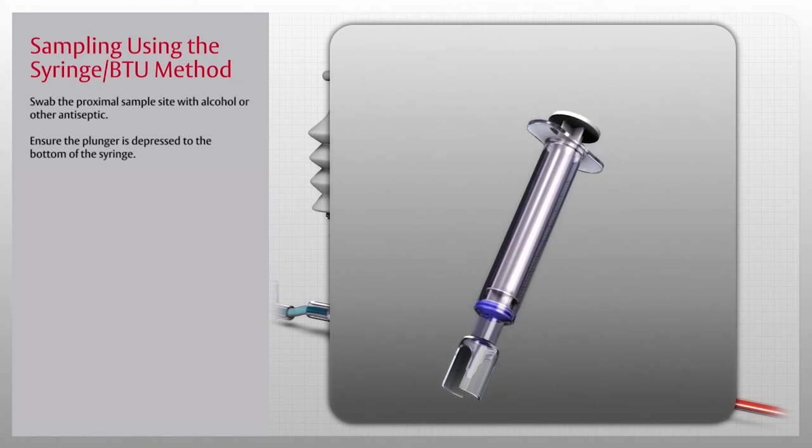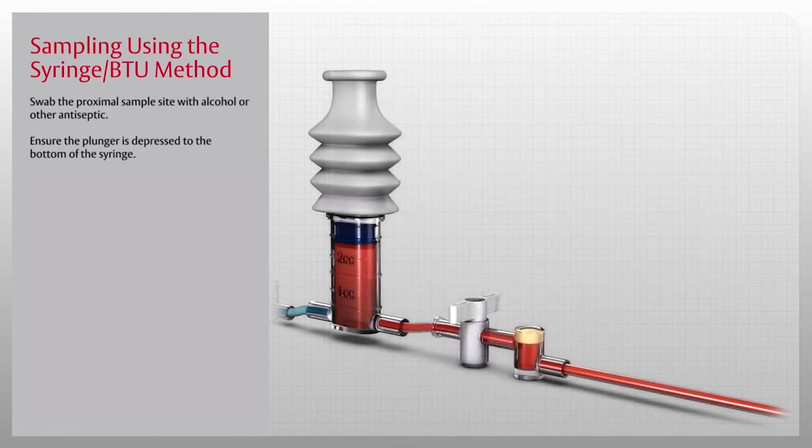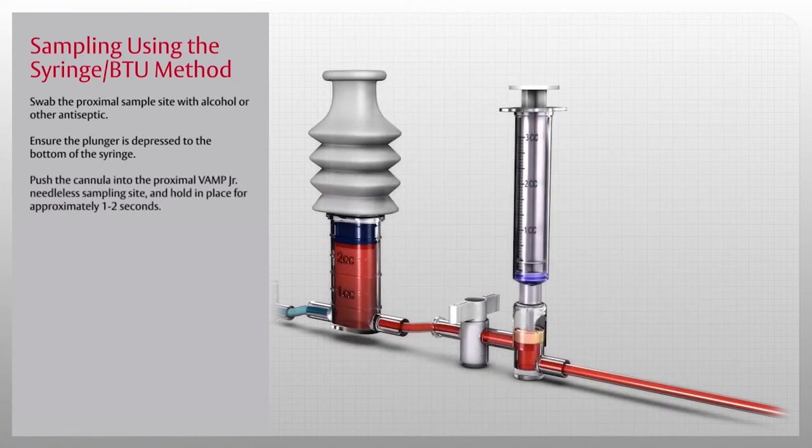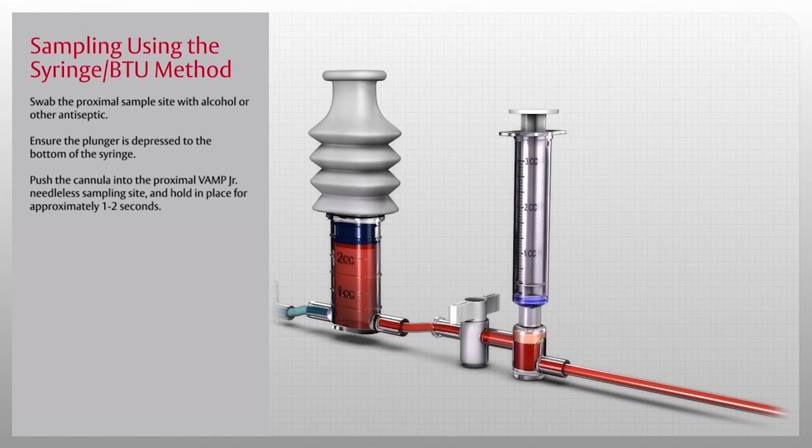Next, attach the cannula to the syringe. When it is attached, push the cannula into the proximal Vamp Junior needleless sampling site, and hold in place for approximately 1 to 2 seconds.